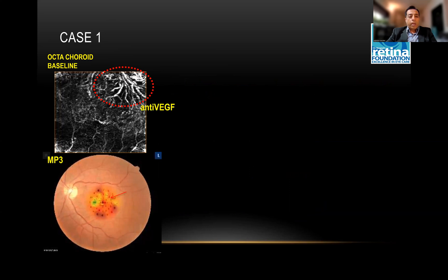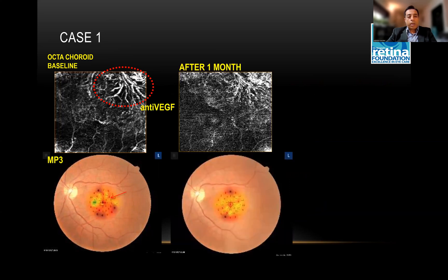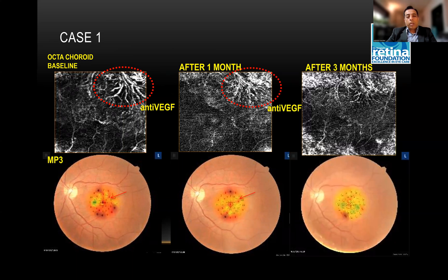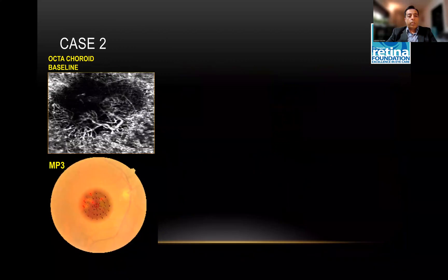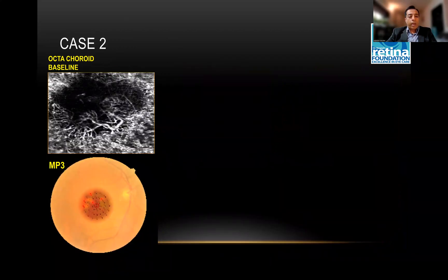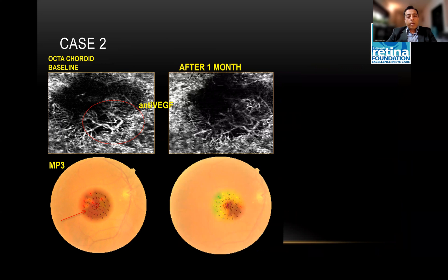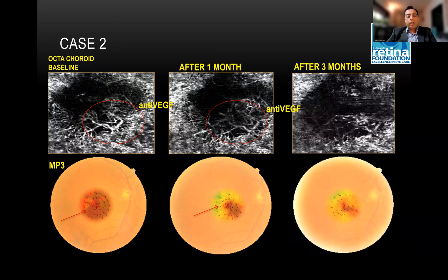You can see this case has a network. We started the anti-VEGFs, and after a month you can see that the microperimetry improves along with the OCT angiography. After three months, the network has almost disappeared on the OCTA, and the microperimetry is almost becoming yellow to green in that region. This is another case: you can see the network and extensive fluid at baseline. Once you start treating, the red colored hue representing low sensitivity keeps getting better with yellow-green colors after injections, and continues improving at the third month.